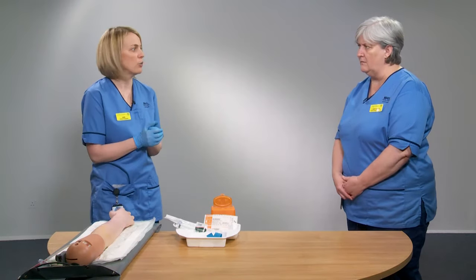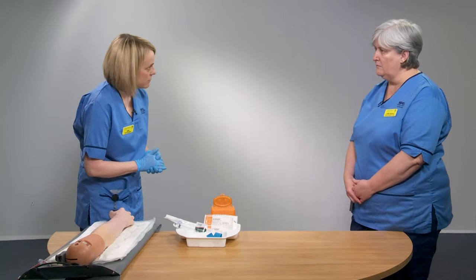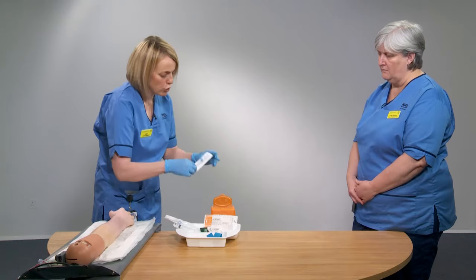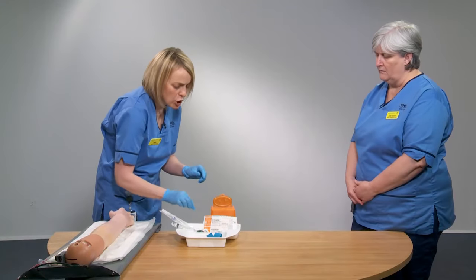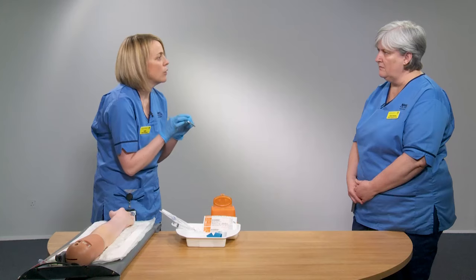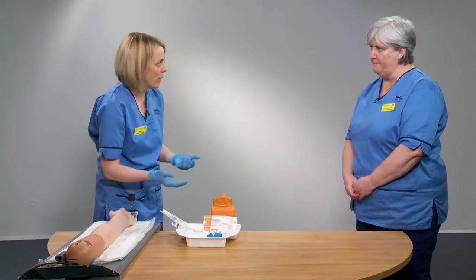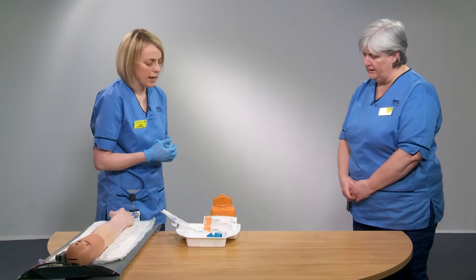For the purpose of this demonstration I'm just going to wear the blue gloves. I'm just going to show you the equipment you would need for cannulation — you can see that it's all on a clean tray. The first thing you need is a cannula of an appropriate size, and then something to clean the skin with: the chlorhexidine wipe. For cannulation it must be a chlorhexidine and alcohol wipe. We commonly use the cleaner wipes in this organisation, as long as it contains chlorhexidine and 70% alcohol.